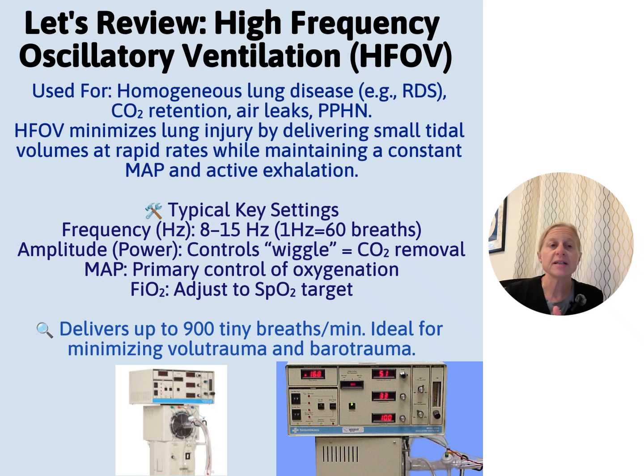The high frequency oscillating ventilator, to me, always reminds me of home. It was the first high frequency ventilator I used, once we couldn't use the conventional ventilator for whatever reason. Most likely it was PPHN. I saw it with hypoplastic lungs, and babies with severe CO2 retention.